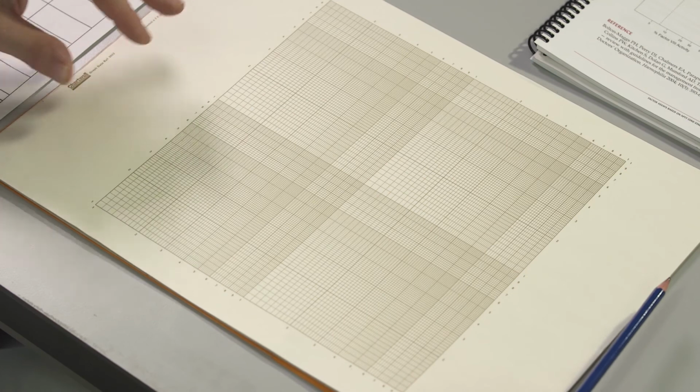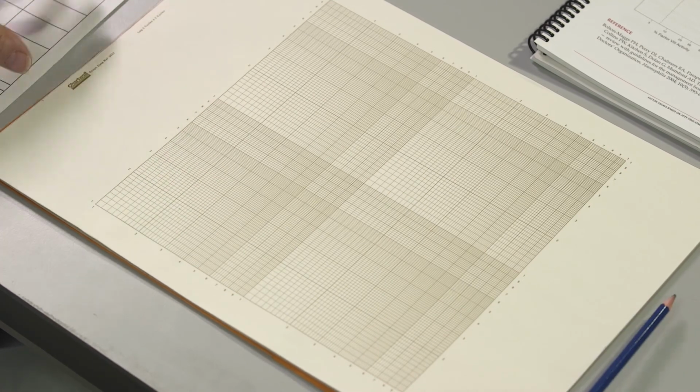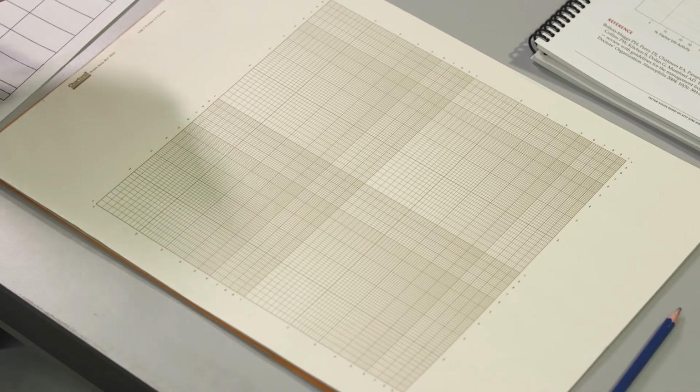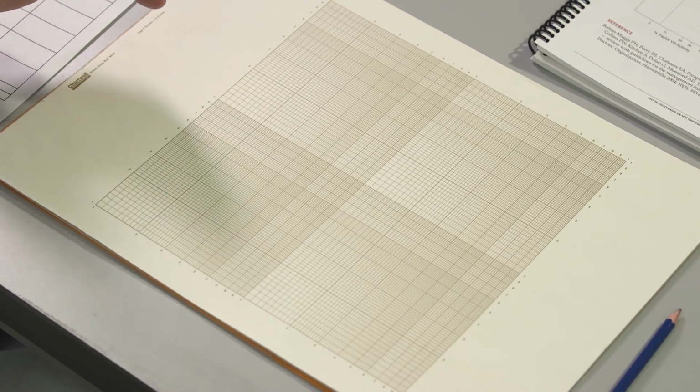The graph paper we're using just now for the calculation for the one-stage factor VIII is double logarithmic. It's acceptable to use log linear paper. This also normally gives a straight line relationship for the calibration curve. So either can be used. We're using log just now. We noticed for the reagents that we've been using for this demonstration, this normally gives a better line using this graph paper.